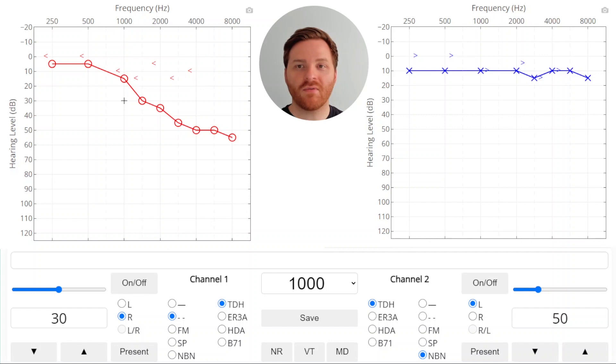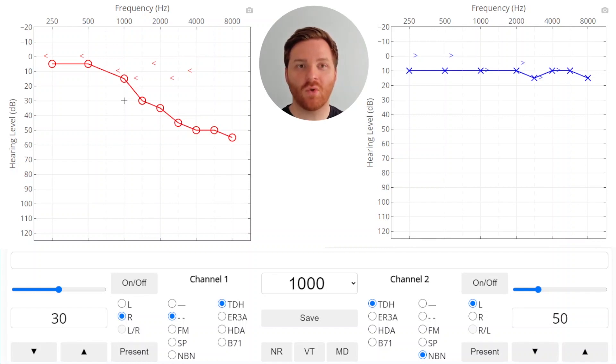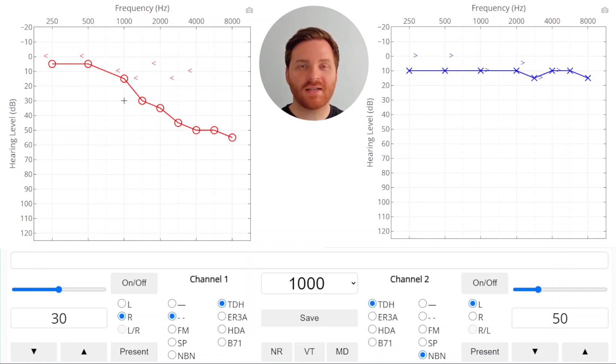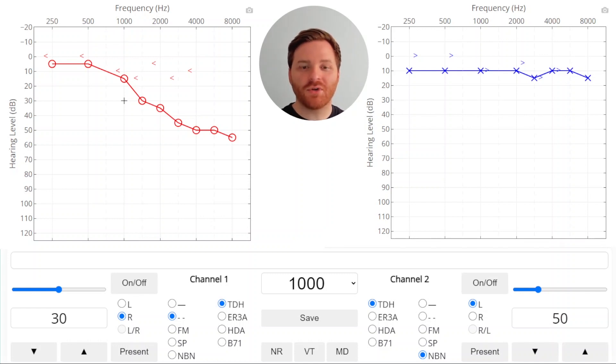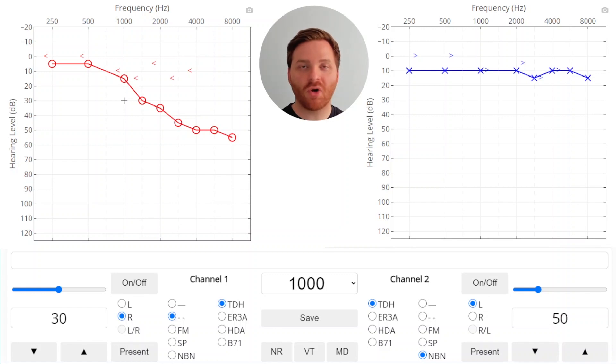Okay, so here we go. We've got our right ear which has a sloping hearing loss and our left ear that has a flat normal hearing looking audiogram. Let's check out air conduction first and decide if we need to mask. I should add in this video we're doing everything using TDH50 headphones which is a supra-aural transducer.